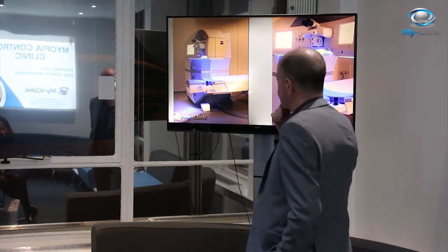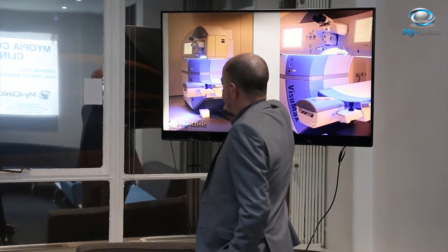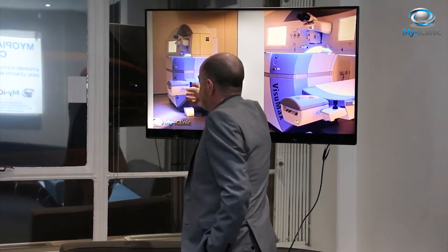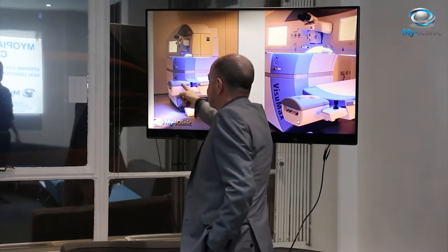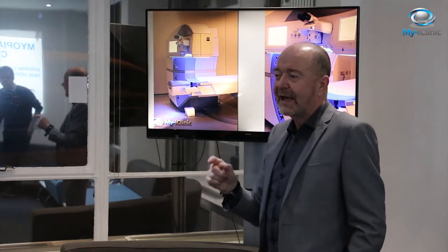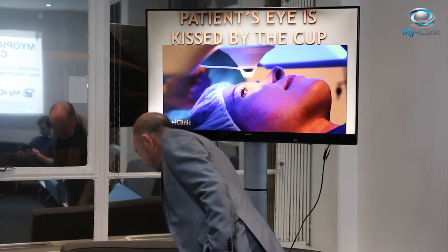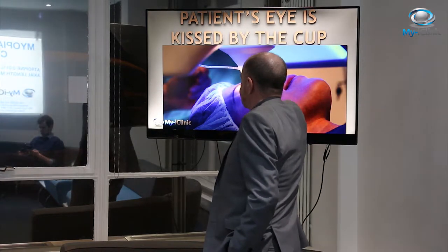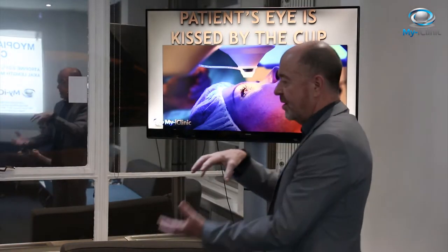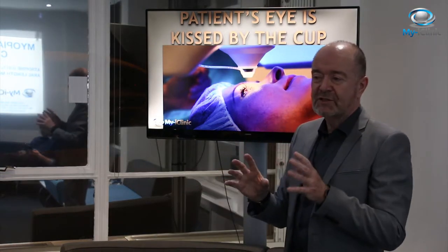This is the machine. The patient lies on this table, and what's very interesting is that it's the table that moves, not the laser. When we dock the patient onto the machine, we use this joystick here to move the patient onto the laser head. It's really amazing — it's about half a millimetre accurate. We maneuver it into place, getting it exactly on the center of the visual axis, which is very easy to do.